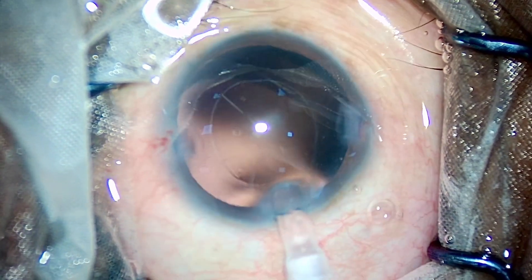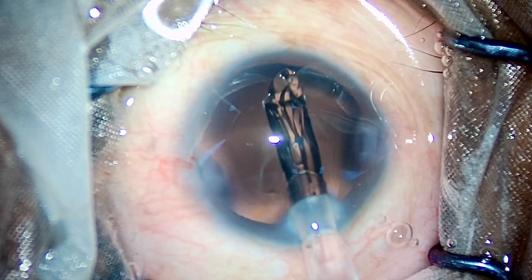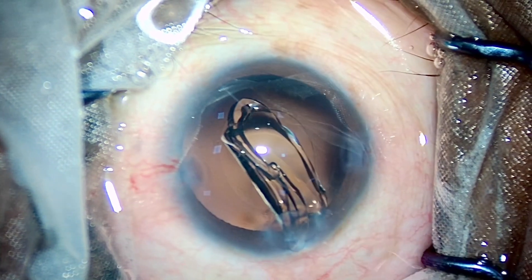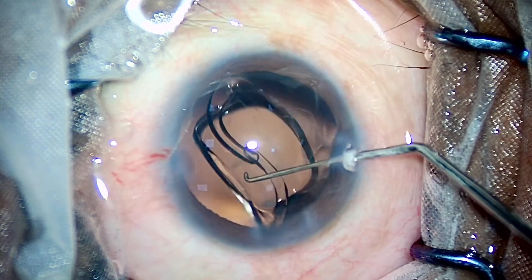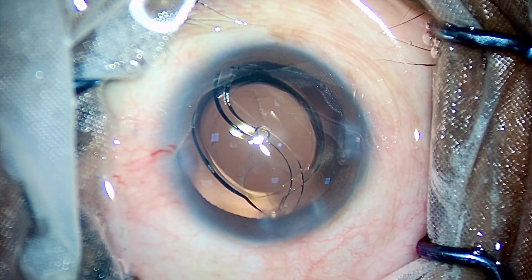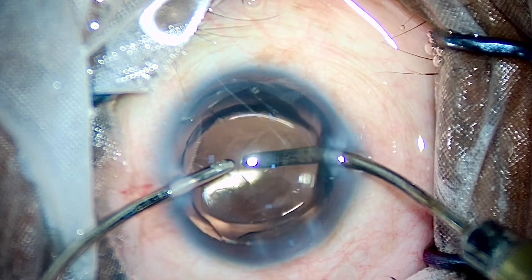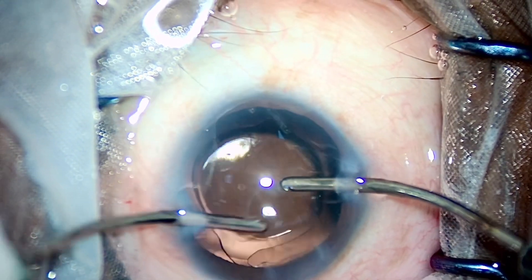When I saw this in real time I just smiled and laughed. First I was taken aback for five or ten seconds — I really felt, how could I do a PCR? Because chamber stability was normal, the AC did not shallow, the vitreous did not prolapse, yet I could see this circular defect floating around. But as soon as my brain registered all this info, I realized and laughed at myself, because this is a Weiss ring from posterior vitreous detachment — nothing else. This circular structure was attached to the disc margin and as the patient aged it detached. The patient is a postmenopausal female, and under the influence of dipping estrogen levels, postmenopausal females usually have these Weiss rings floating around in the vitreous.